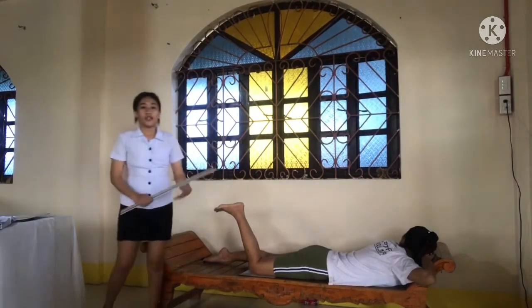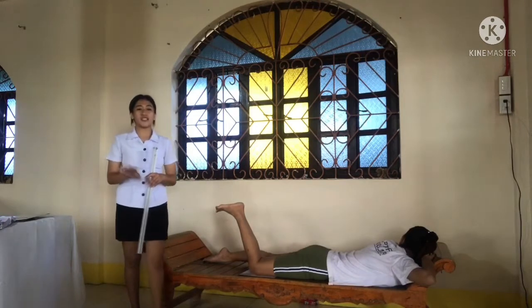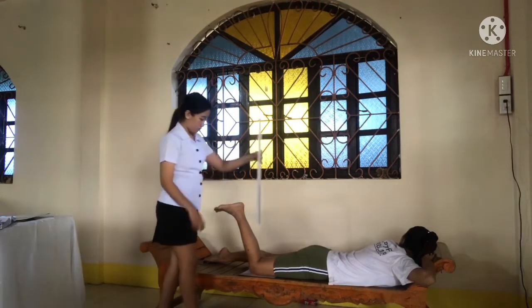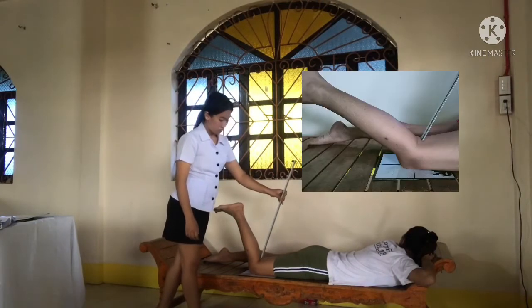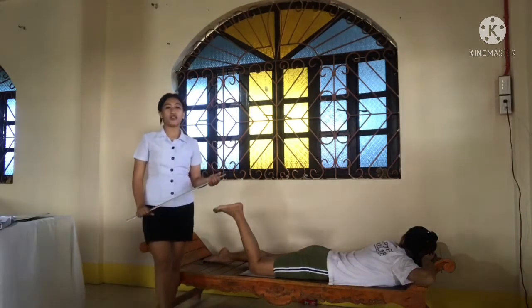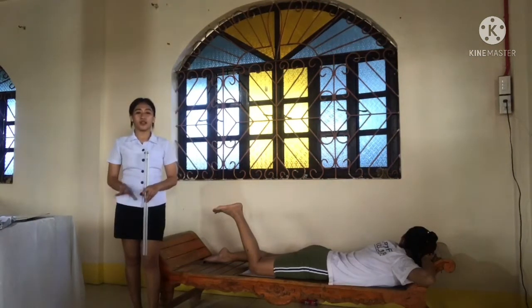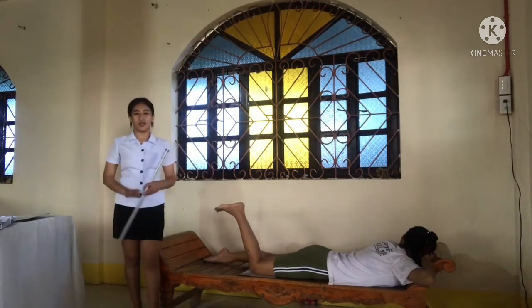So, the central ray for this projection is perpendicular to the long axis of the leg and centered to the knee joint. This demonstrates an unobstructed projection of the intercondylar fossa and the medial and lateral intercondylar tubercles of the intercondylar eminence.